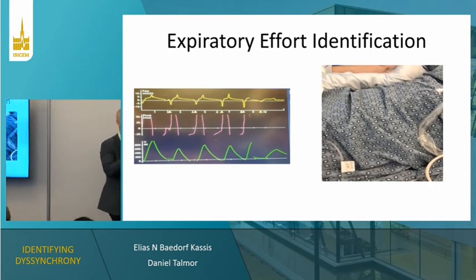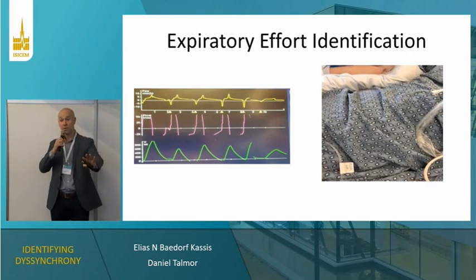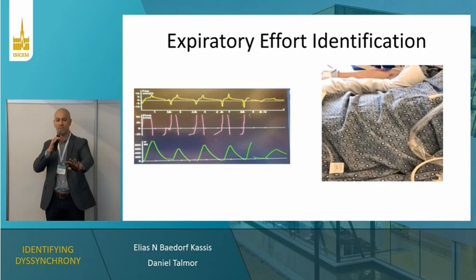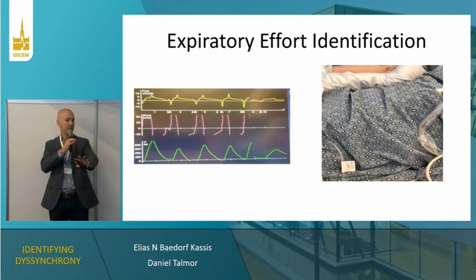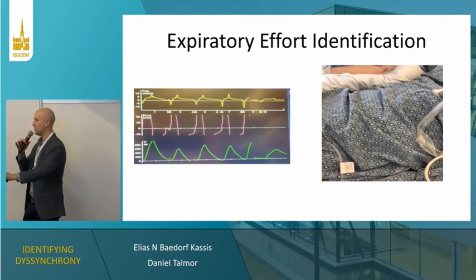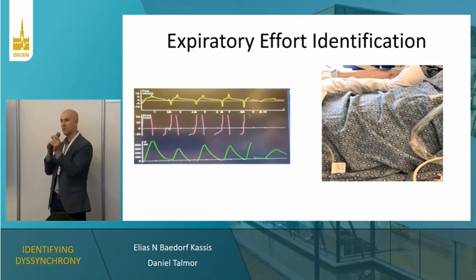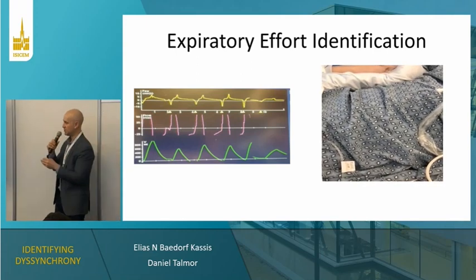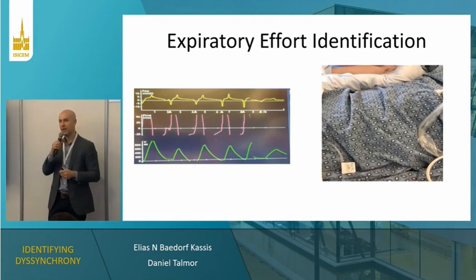What I always teach our fellows and residents is, when we go to the bedside, put one hand on the chest and one hand on the abdomen, and feel what the abdomen is doing during the expiratory phase. You can feel the abdominal muscles in patients who are having this frequently engaging and contracting in response to the inspiratory phase to actually terminate it. And this is actually a fairly minor example of it. In some cases, you can see that it's actually quite dramatic.